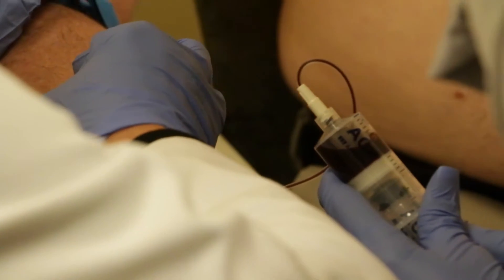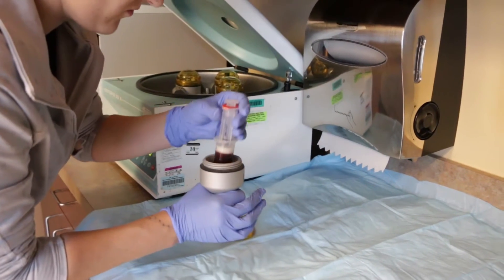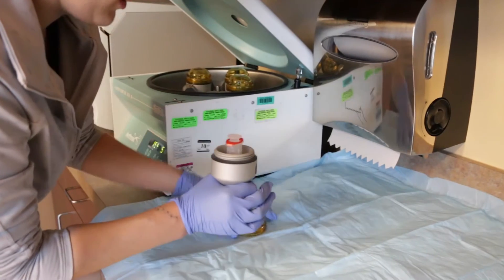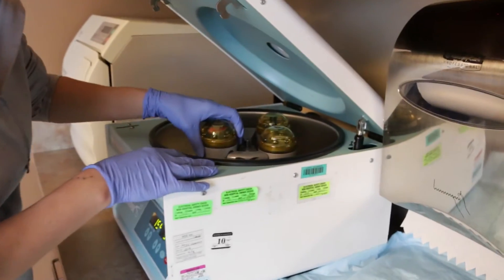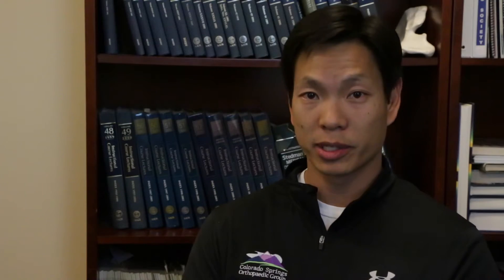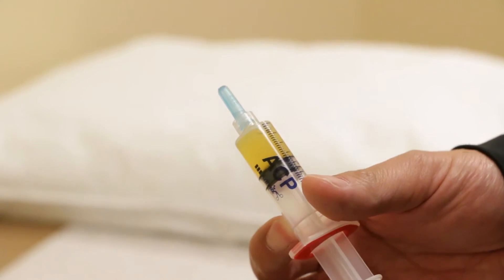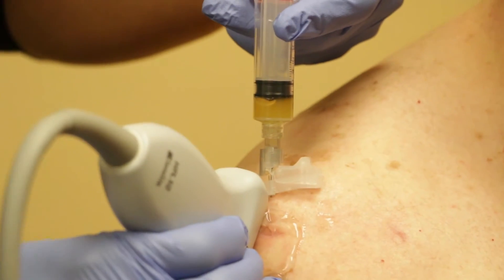We don't actually need a lot of blood from the patient — something like 15 milliliters up to 30 milliliters. That sample is then taken to a centrifuge and spun through a proprietary filter, which is a one-time use specific to just the one patient. We end up with around 3 to 5 cc's of platelet-rich plasma, which we then inject into the patient at whichever site we're interested in.